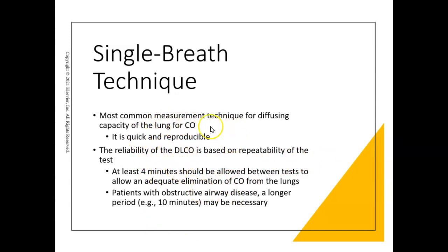So the most common is that single breath technique. I think the only thing I missed from when I was talking about this earlier is that you have to wait in between attempts. You still have to reproduce this test. You can't just do a one and done. For reliability purposes, I have to repeat this test.